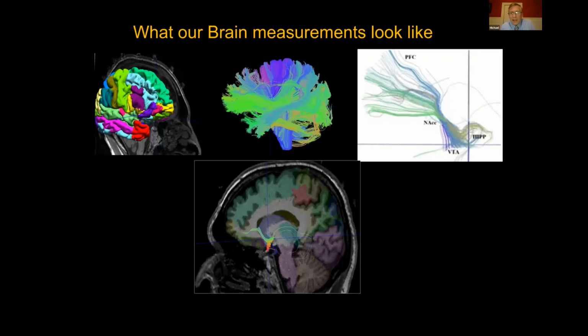Last couple slides coming out of our lab, just to wrap up. You've heard me talk about all these different techniques. Now what we can actually do is get down to the individual brain regions. So this is my image, so I can talk about this. Here's my broken nose. This is the three-dimensional brain image that we've reconstructed. I then go in and create all the white matter pathways of that image, and I can zoom into regions like the hippocampus, ventral tegmental area, and nucleus accumbens, and look at the specific fiber pathways.